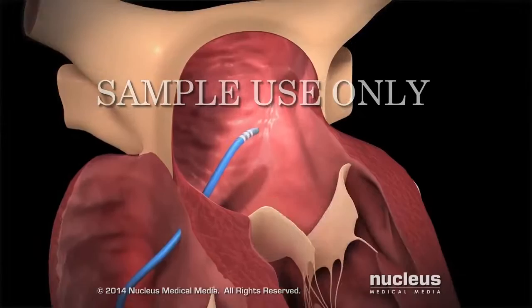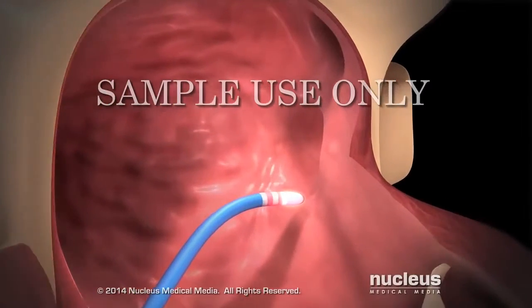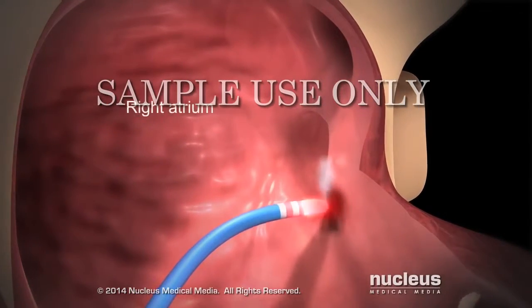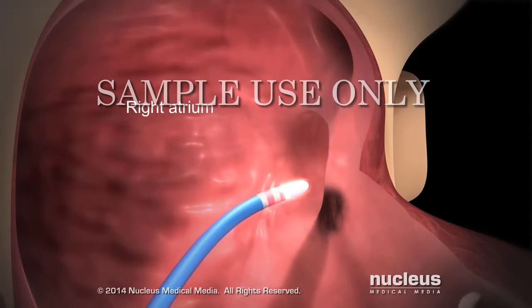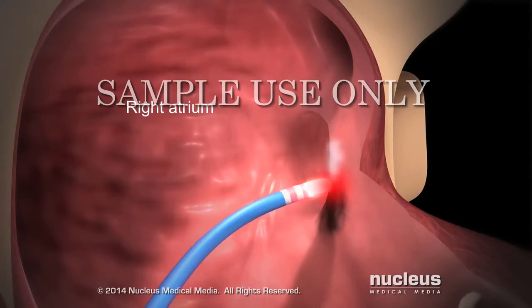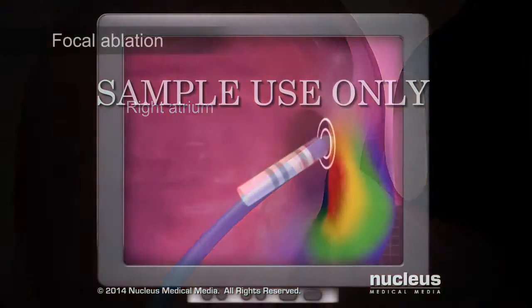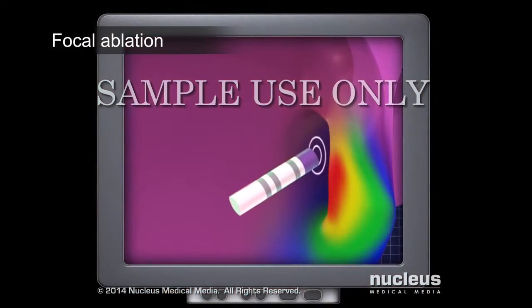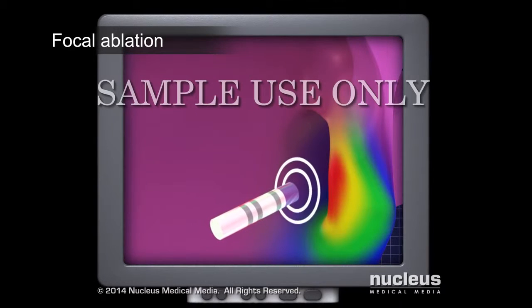For an atrial arrhythmia, a doctor will ablate the atrial tissue causing it. If the affected tissues are small, well-defined areas, the procedure is called focal ablation.